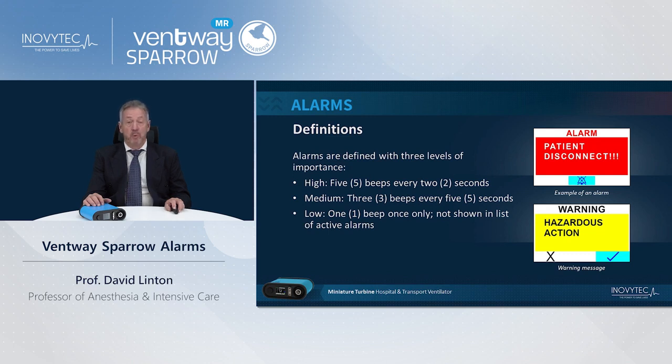There are also the warning signs for any hazardous action that you may take during the ventilation. For example, if you want to change the ventilator parameter, which will stop the ventilator temporarily, or if you want to change to a new patient. So in this way, you will have to identify what you want to do again by moving the cursor to the tick and clicking that that's exactly what you want to do, and be ready to respond to what will happen if you do that.